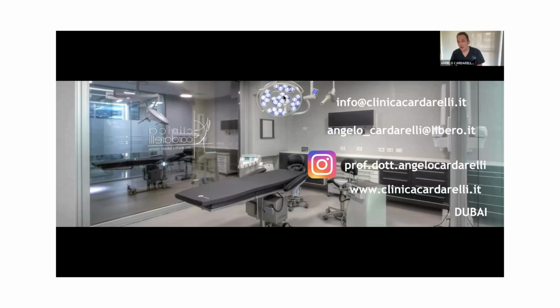Yes, the incision, no, not in the crest. The incision is always in the upper jaw more palatally, and in the lower jaw more lingually. Not in the crest. Absolutely not. Why? Because on the upper, I want to move the connective tissue from the palatal side to the buccal side. The same in the lower jaw on the lingual side, where we don't have enough connective tissue. But the incision is always a little bit lingual, never in the crest, never.